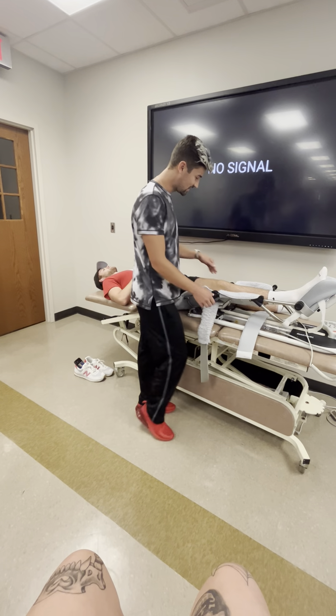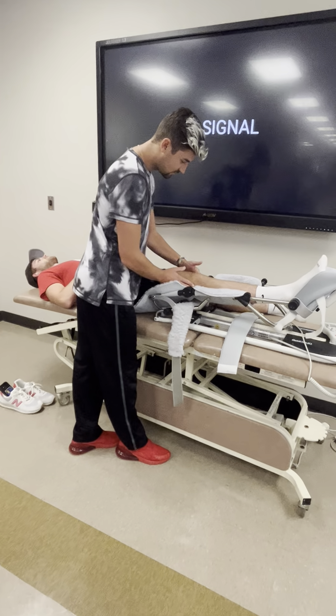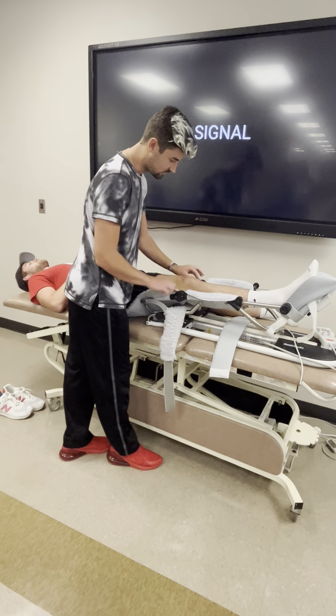Hi Alex, we're gonna go ahead and measure in here. So let's go ahead and measure.